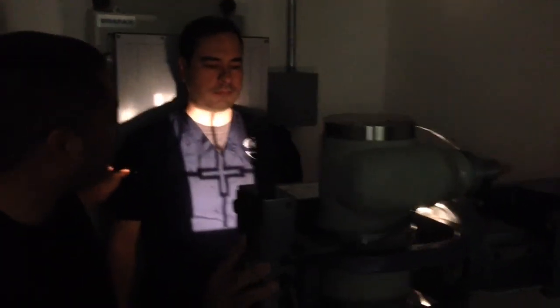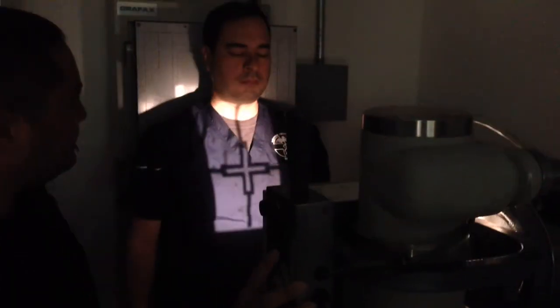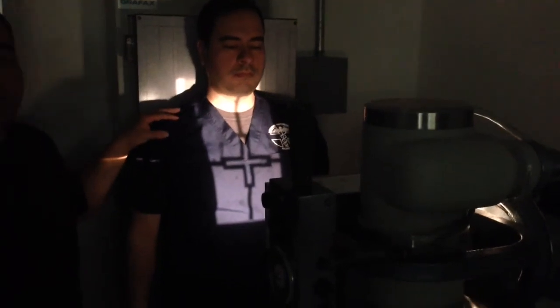Arms down. So we don't have magnification anymore from the OID, so we can raise this to 1.5 to 2 inches above the shoulder. And there's your AP T-spine.